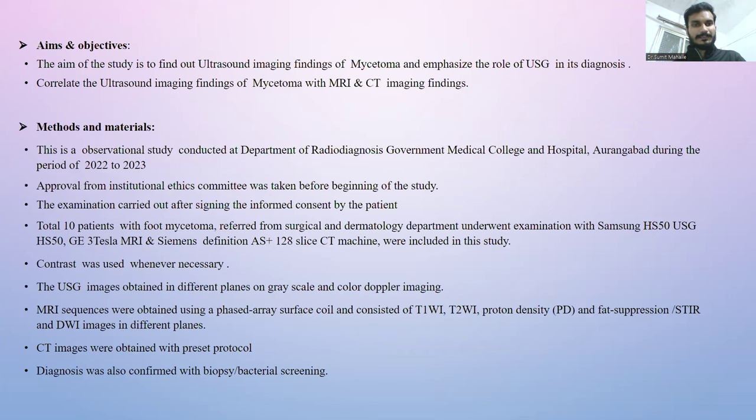So, the aims and objectives of this topic: the aim of the study is to find out ultrasonographic imaging findings of mycetoma, emphasize the role of USG in the diagnosis, and to correlate the USG findings of mycetoma with the MRI and CT scan imaging findings.